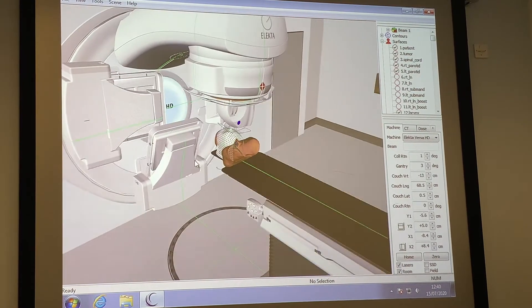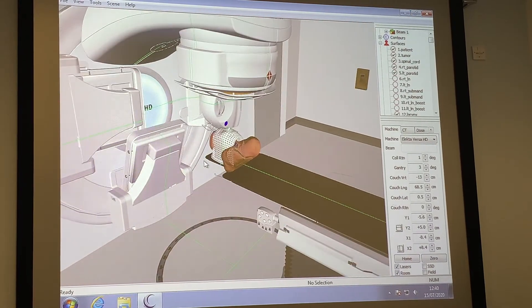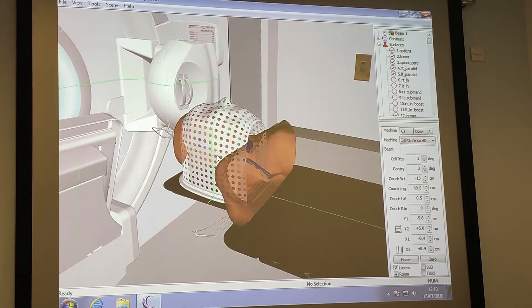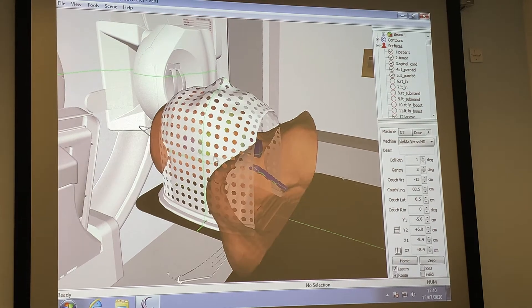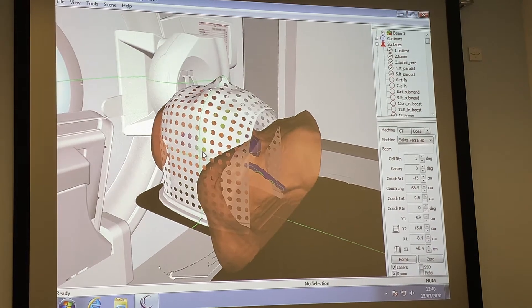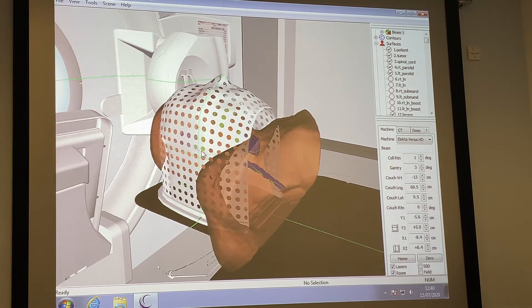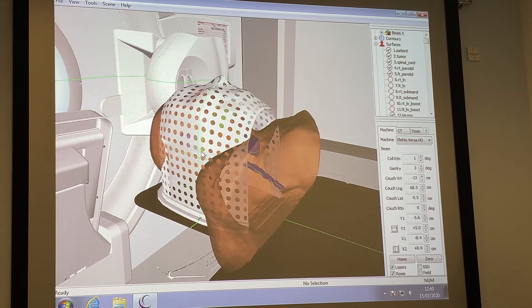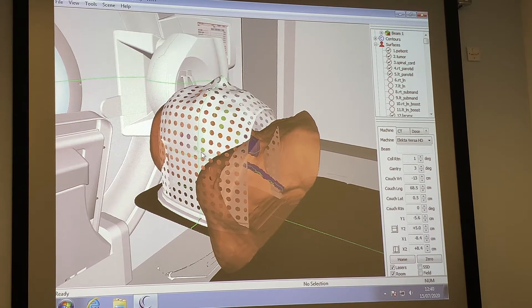There would be a face mask, which minimises patient movement — involuntarily or otherwise — and allows us to direct our radiation beam accurately.